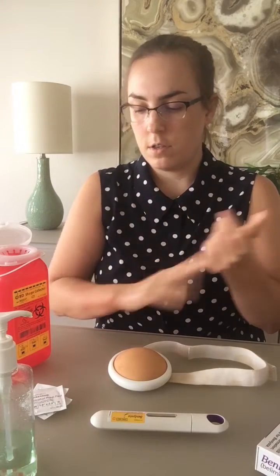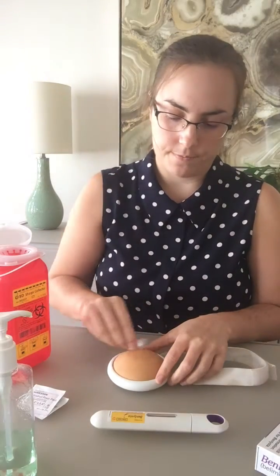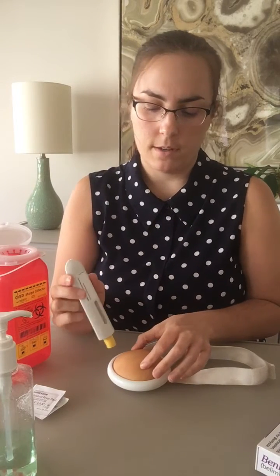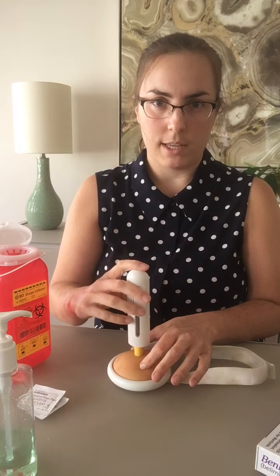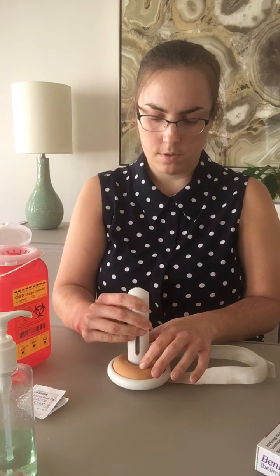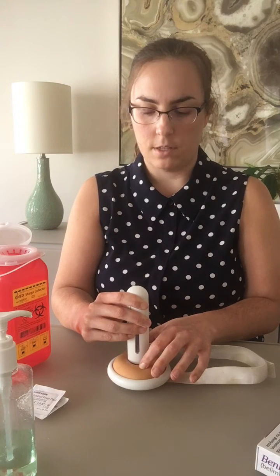First things first, we're going to wash our hands, and then we're going to take an alcohol swab and clean the skin. Then you're going to take the medication and twist the cap off. Put it to the side — never, never recap. You're going to place the medication at a 90 degree angle with the window facing you so you can see the medication going down. Make sure that everything gets in, and then firmly press down. Typically it takes about 15 seconds, and then you're going to release.